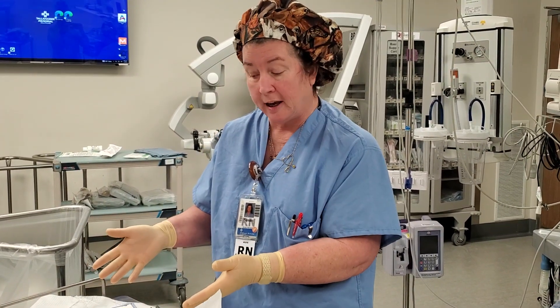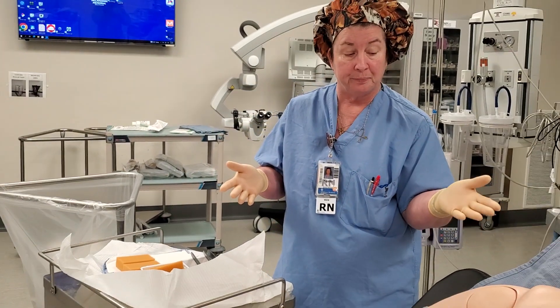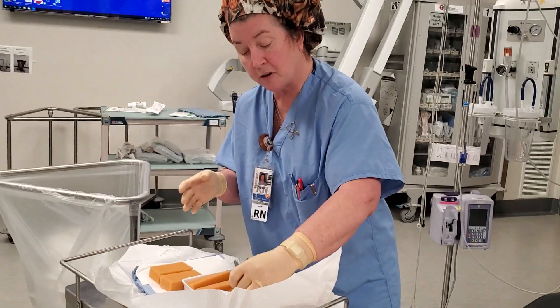If using Betadine to prep a shoulder, we're going to make sure that we have prepared our prep kit, put our towels underneath our patient, donned our sterile gloves. Then we're going to use the scrub solution.